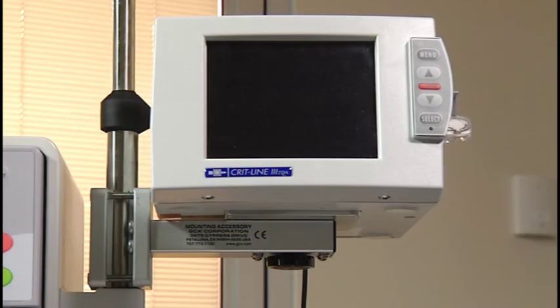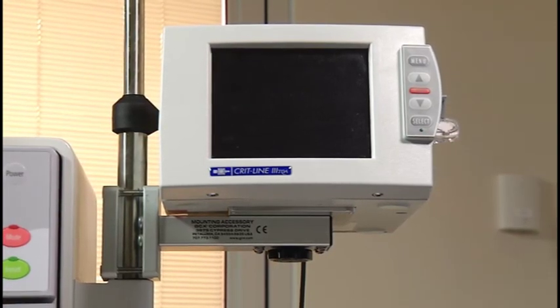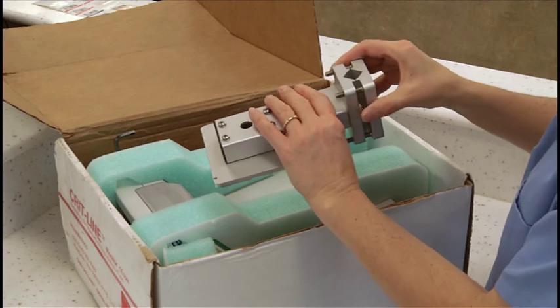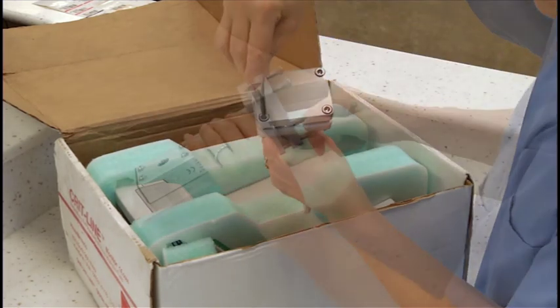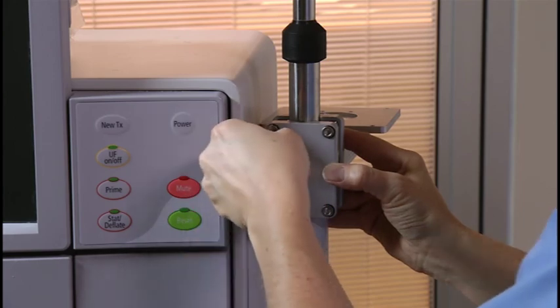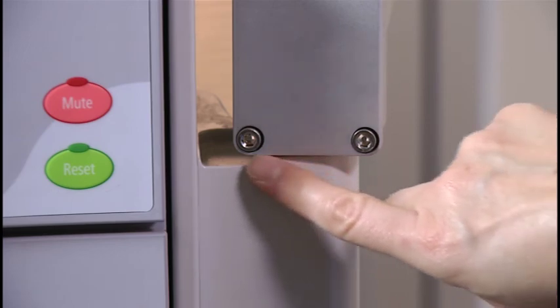The CRITLINE monitor is designed to mount on the IV pole on the 2008 hemodialysis machines. To attach the CRITLINE monitor to the 2008 series IV pole, remove four screws from the pole mount bracket using the hex wrench included in the CRITLINE monitor box. Secure the pole mount bracket to the wider top portion of the IV pole by replacing the four screws with the hex wrench. The pole mount should rest comfortably on top of the IV pole holder attached to the machine.